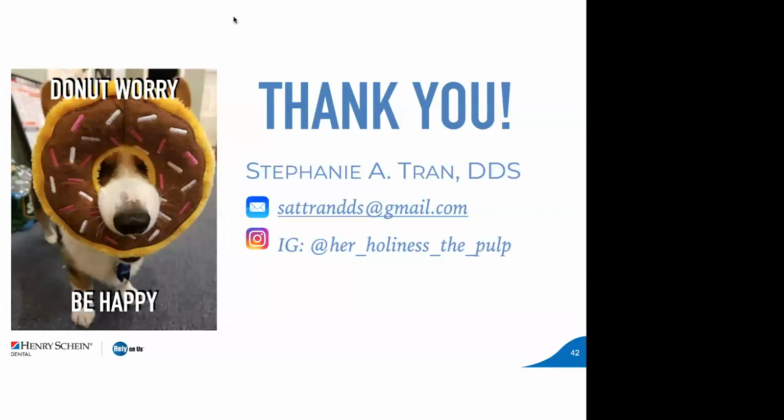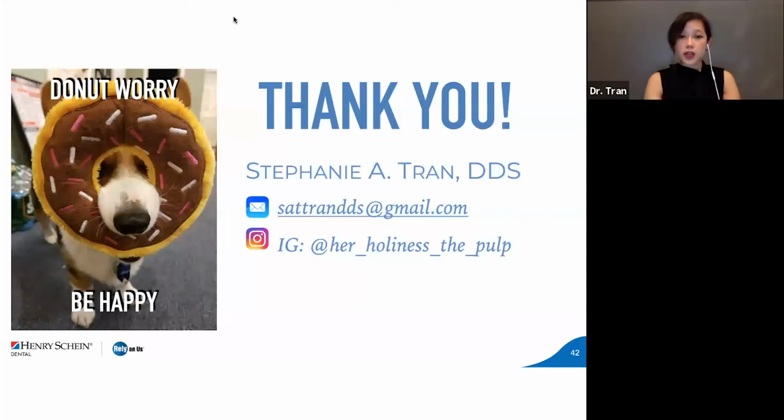How do you clean the pulp chamber on the most minimal accesses? That's a great question. There's a few ways to do it. The nice thing about that inverse funnel design, or even the caries directed, caries leverage or restoration leverage accesses, is that I'm purposefully angling it so that the pulp chamber is still fully visible, and we're able to clean it out fully and actually access into the pulp horns as well.